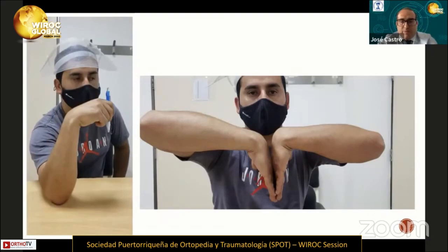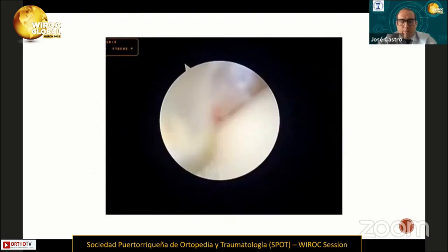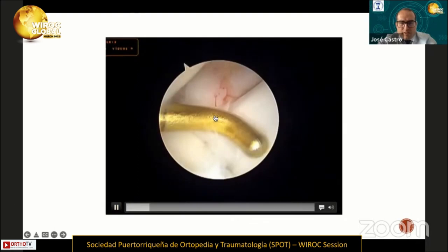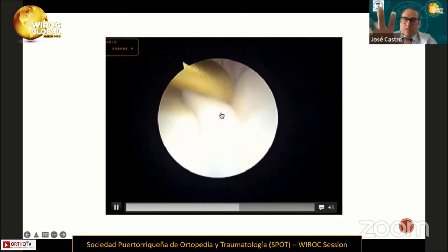This is another case: a 50-year-old female who performed manual work and had pain in the dorsal aspect of the wrist for nine months. Clinical examination revealed Watson's sign positive. She performed physical therapy for three months, but the pain continued. We evaluated the scapholunate ligament and found the probe entered between the scapholunate ligament on the dorsal side. We classified this patient as EWAS 3A and performed the same repair.